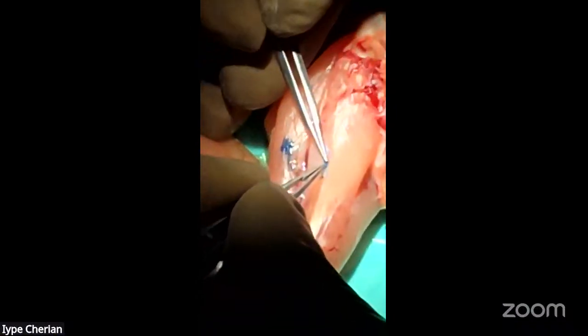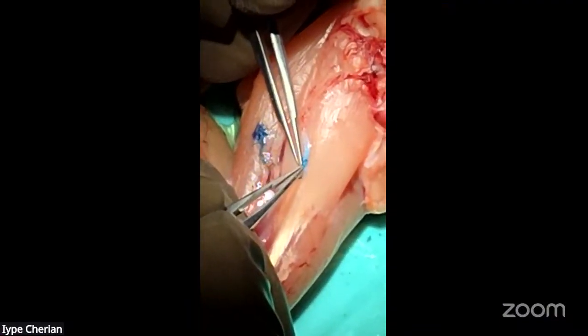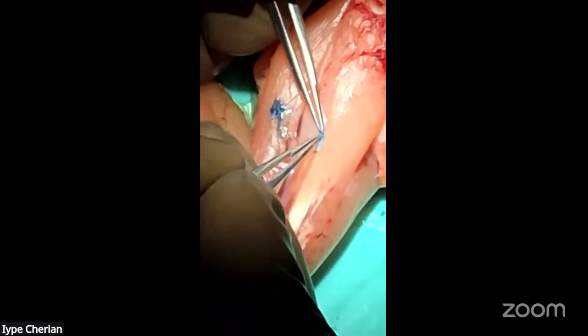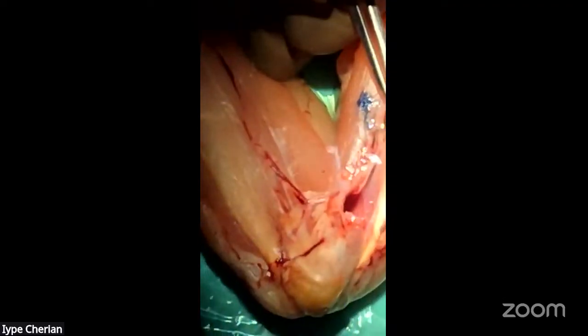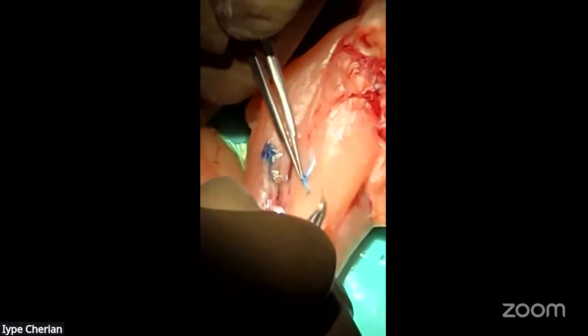John, can you see that I've got about 3 more stitches to go there? You can see well. So I'm going to trim this area which is overhanging. Scissors. I'm going to trim that area.